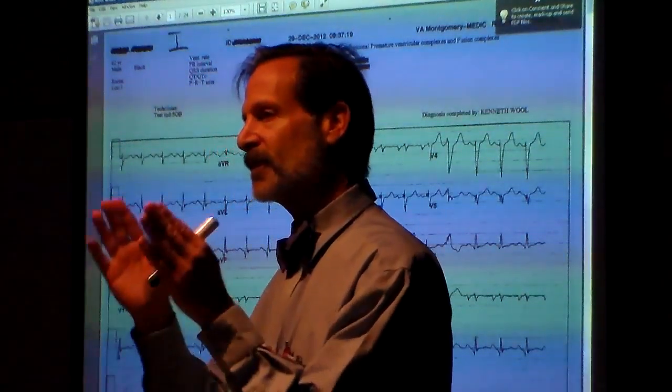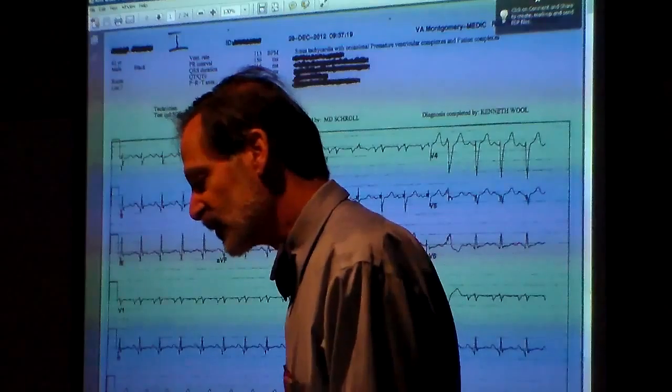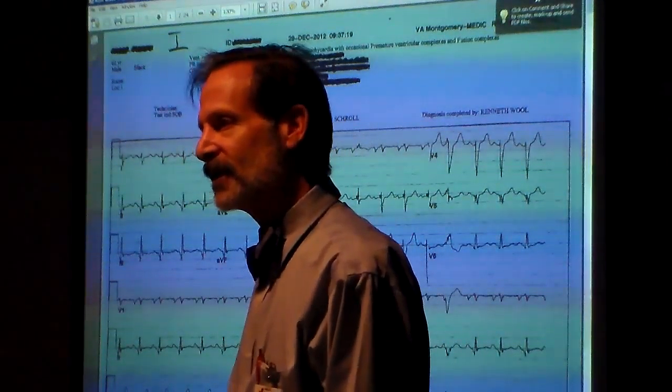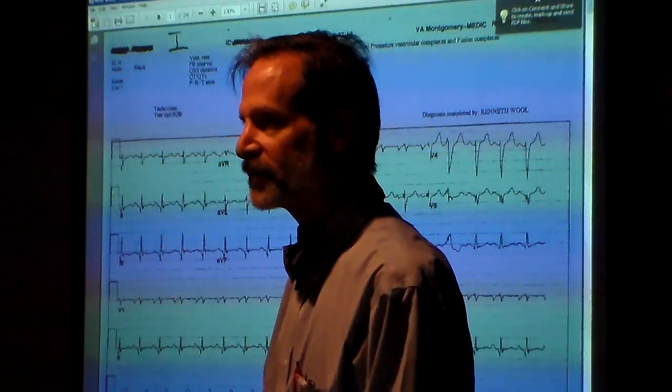And so you have the compensatory pause. If you're tapping it out, you get the premature beat, but the next beat falls right back in time. That's the characteristic of a PVC. And what did you say about PAC? A PAC resets the sinus node so you don't have a compensatory pause.